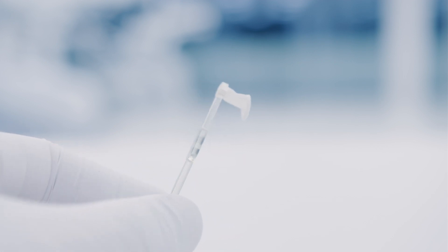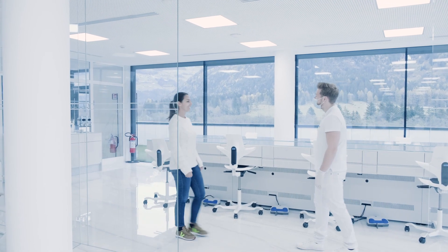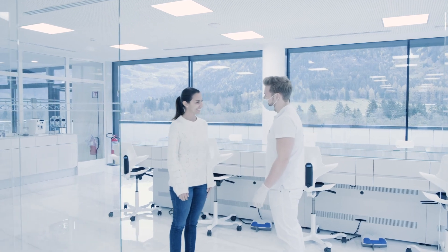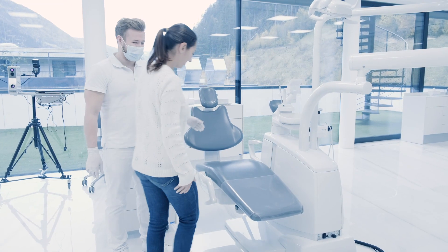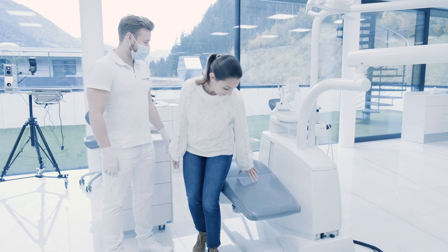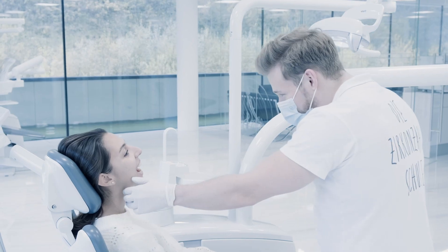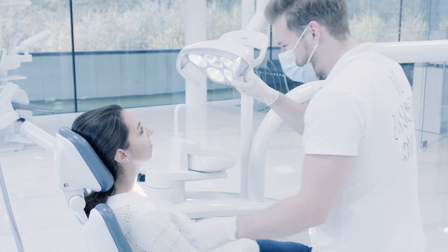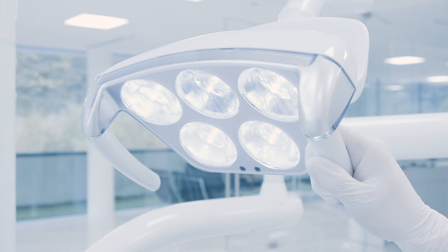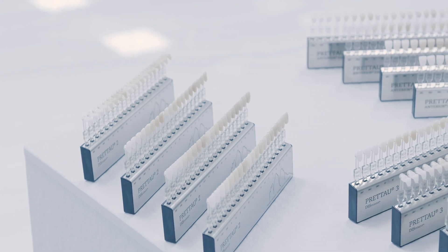The reproduction of the natural tooth color is a very complex process. Ideally, color determination should be carried out under natural daylight or in a room illuminated with standard daylight lamps, avoiding direct bright lights. Human teeth have different degrees of opacity, from quite transparent to very opaque.